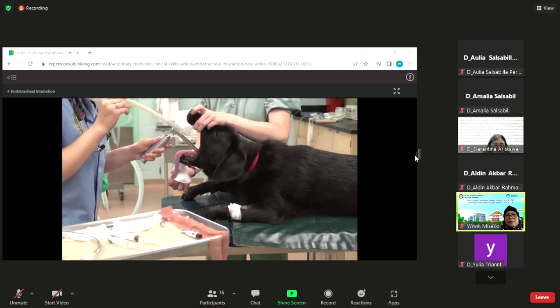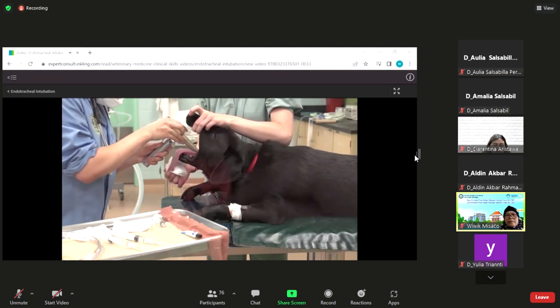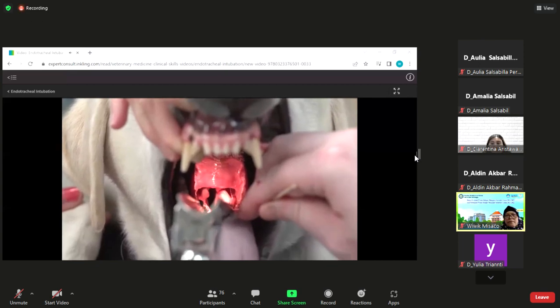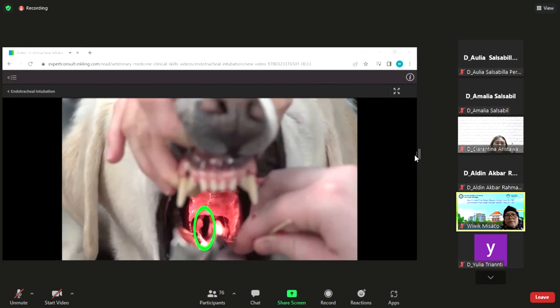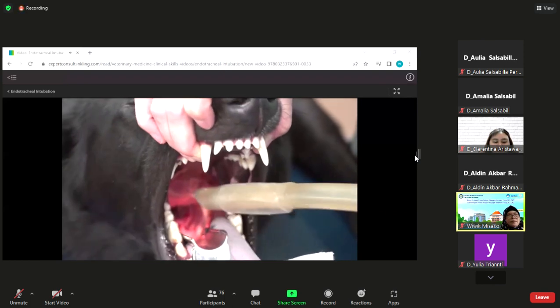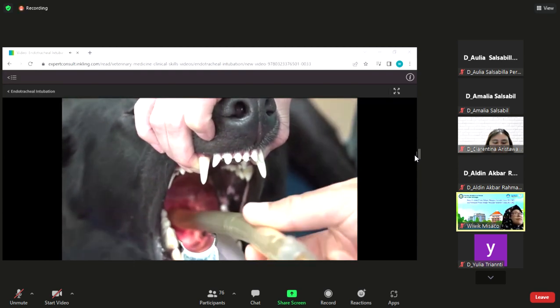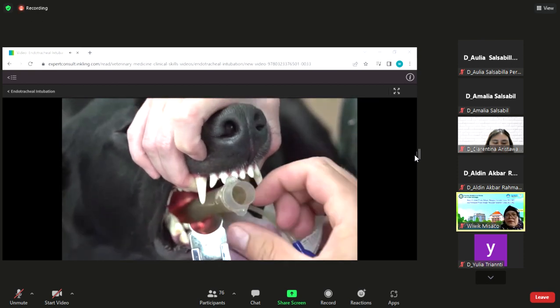The goal is to pass the tube smoothly into the trachea, like this. Let's look at it from your perspective. With the assistant holding the patient's mouth open, you see the soft palate, which you sometimes need to elevate off the epiglottis to reveal the opening of the glottis, like we see here. The glottis is the gateway to the trachea, and it is our target, this vertical black slit. Advance the tube into the glottis, which can be helped by rotating it so the beveled edge enters the glottis vertically. Gentle back and forth twisting motions may be necessary, but the tube should pass between the vocal folds and into the trachea without force.